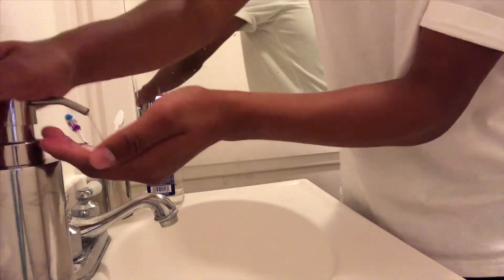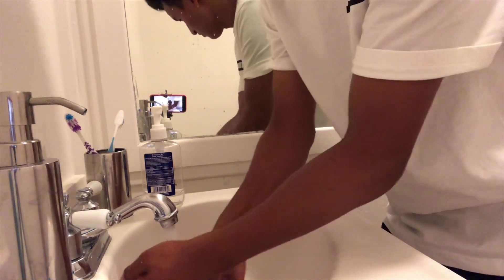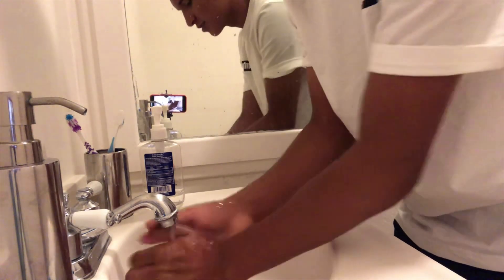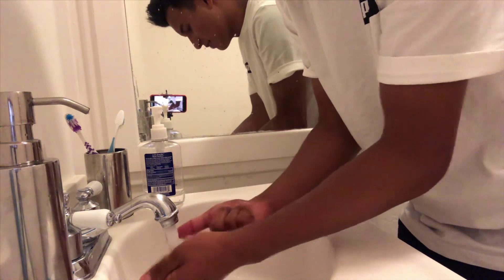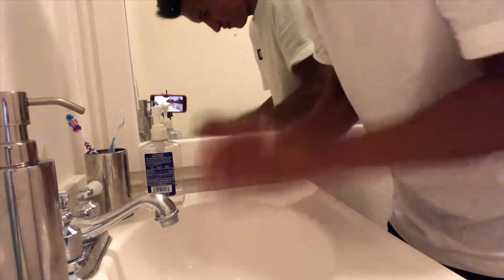I'm currently in the bathroom and I'm going to show you how to take off my contacts. I'm going to wash my hands first. I'm going to set you up right here — hopefully you don't fall. I need to make sure this is the cleanest, especially this thing because this is the one I use to slip out my contacts.